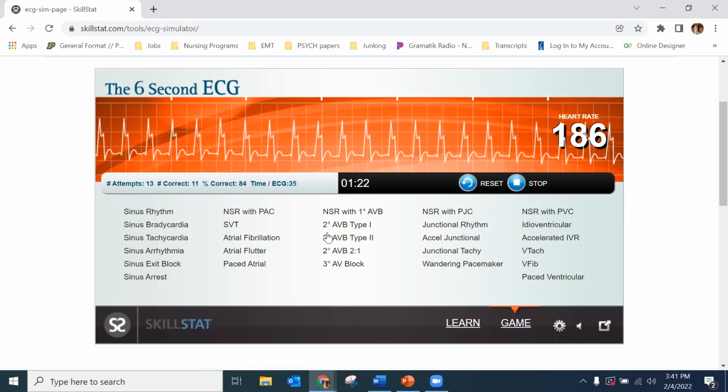This one, I'm gonna skip it. This one's a junctional tach. I think it looks a little crazy, but you don't have P waves. It's over 100. This patient kind of has a bundle branch block. It looks like this is a weird representation of junctional tach.